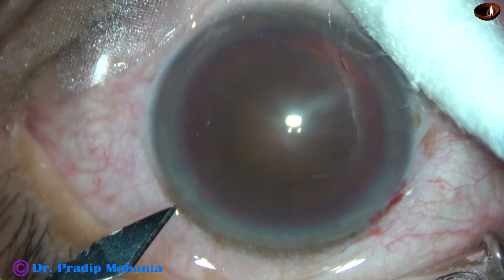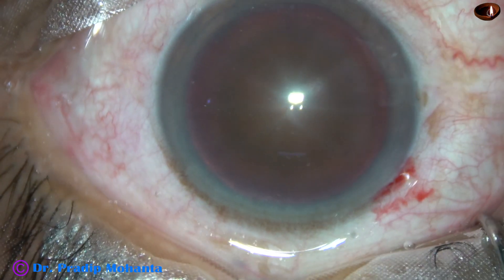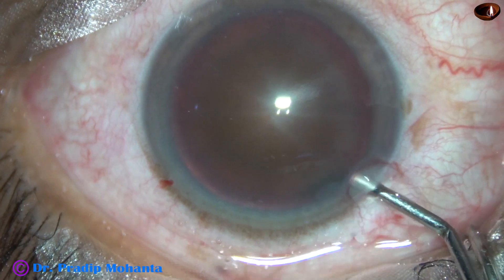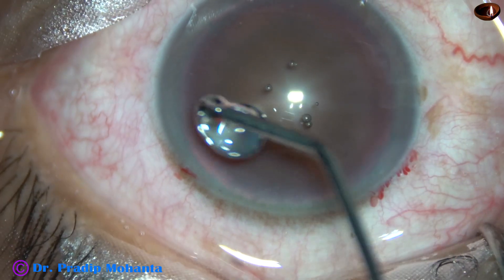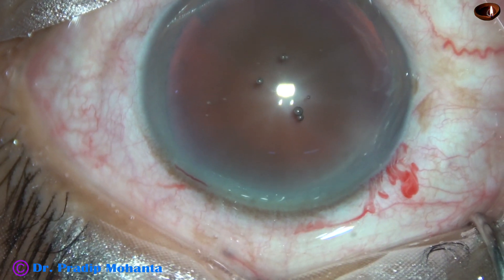The main incision has been made. This is a side port on the left side of the main incision, and in this case I have made only one side port. Viscoelastic substance, 2% HPMC, is used to fill out the anterior chamber. It is applied over the corneal epithelium.